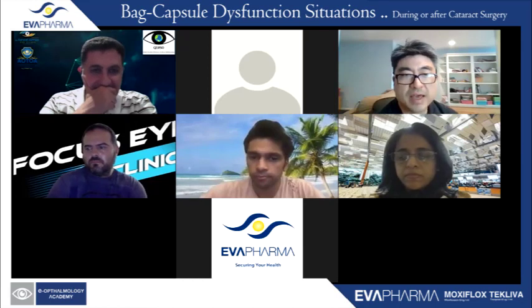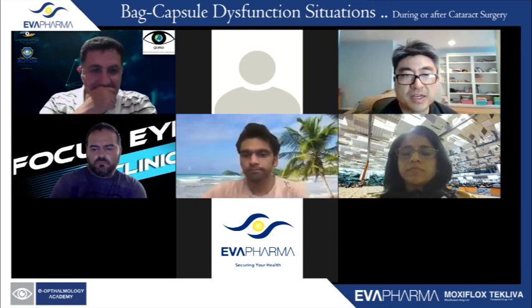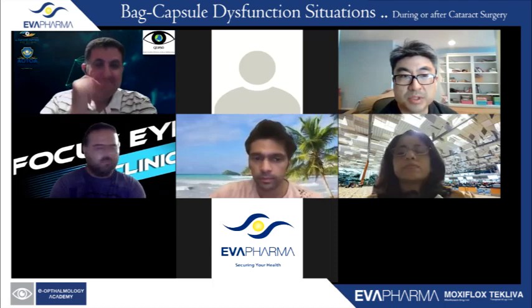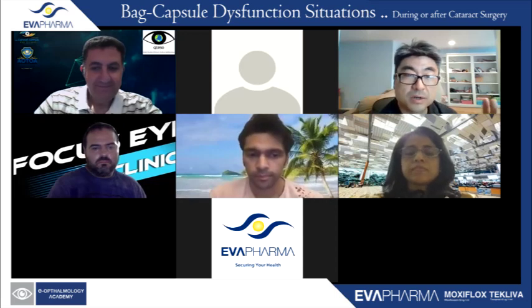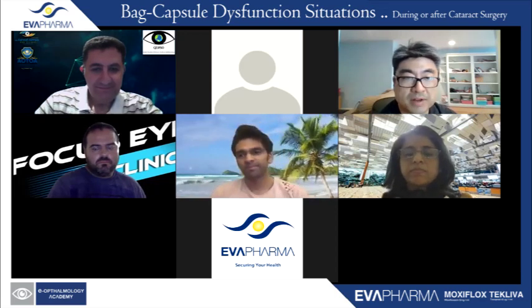You might have atrophy or distortion. And I think the four-throw pupilloplasty technique is so advantageous. It's so quick and easy to do, and so easily accessible to all of us. So whenever we're doing these techniques, if you can see the edge of the optic, absolutely, it's time to go ahead and fix it.